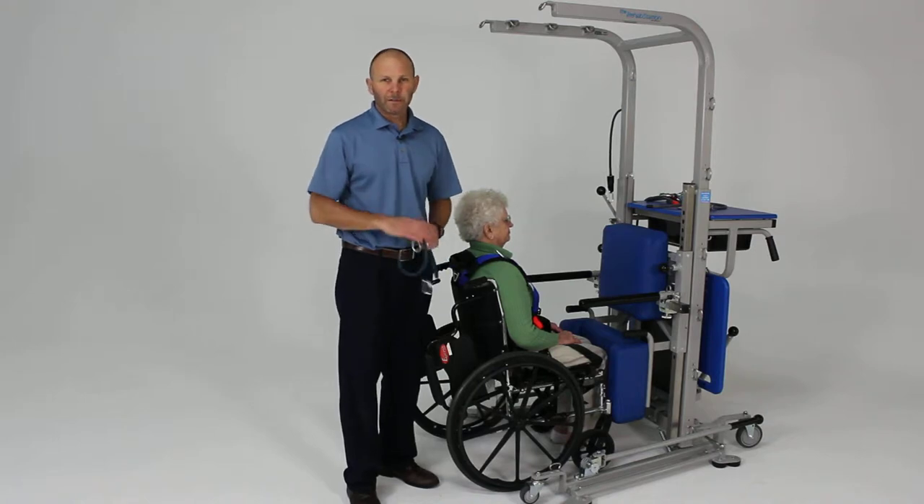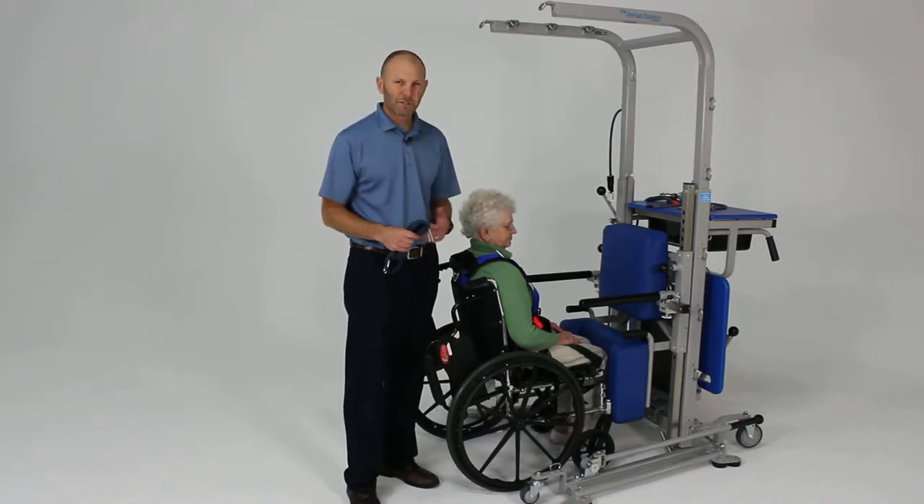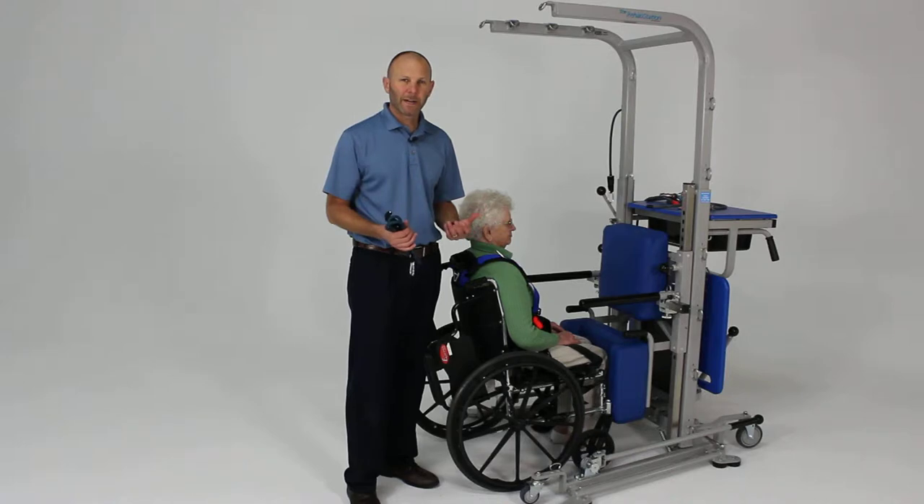We want to demonstrate the numerous functional activities you can perform with the rehab station. This is just giving you an idea of some of the different activities, starting from some lower level types of activities and progressing to some higher level activities.